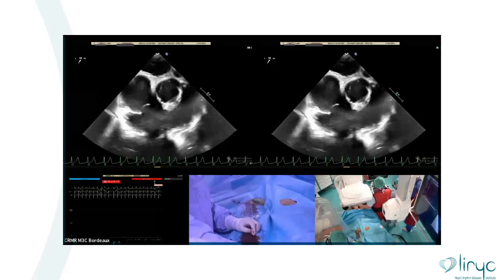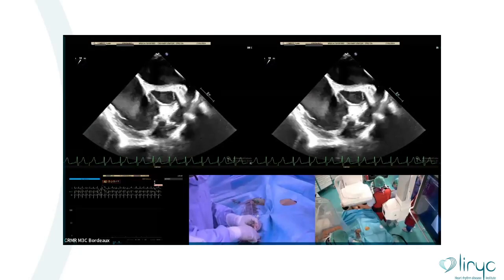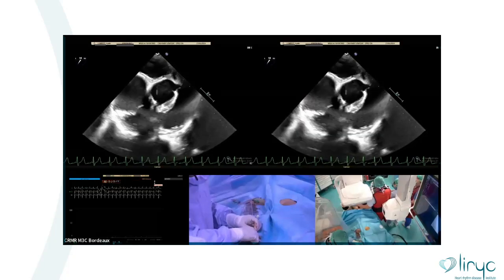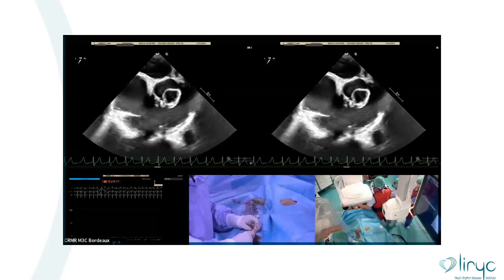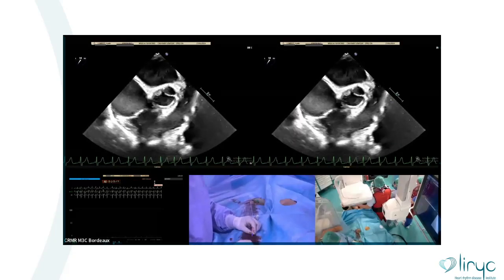Okay. That's the reason why we should use the Cordis wire. Cordis wire will be very clear and echo can guide, we adjust the direction. Okay. And don't worry, in the afternoon we have some presentation. We also have some record to show you the full record, to show you how we pass. Thank you.